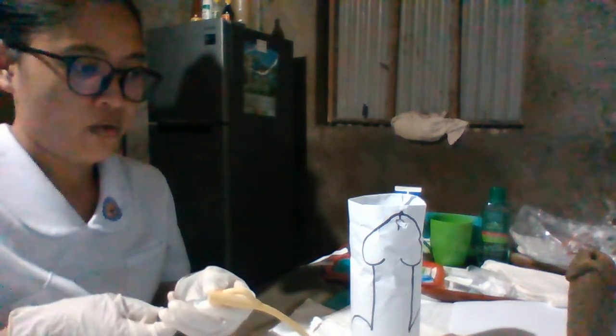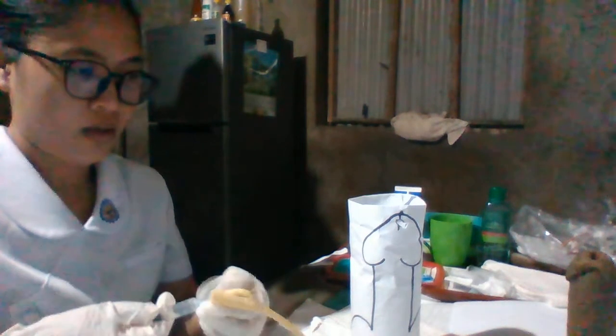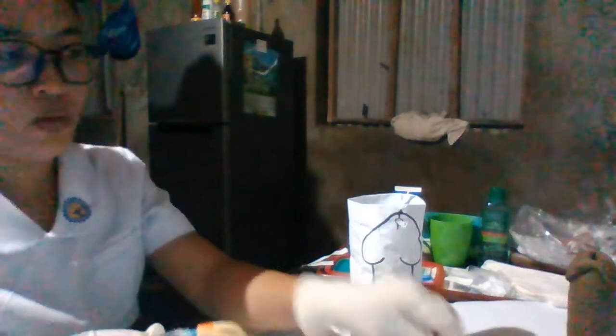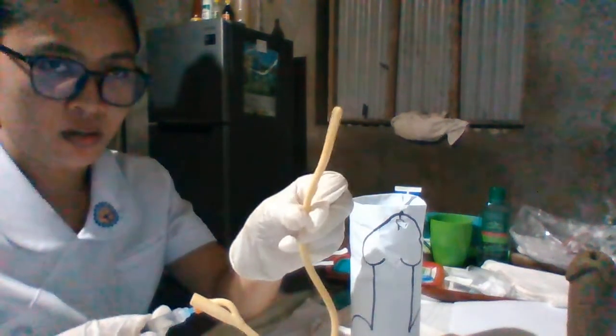So we need to aspirate all the fluid into the syringe. There we go.